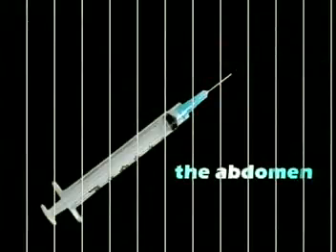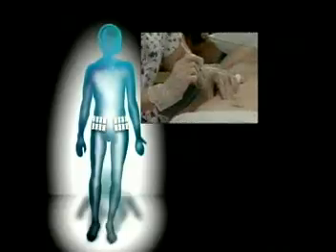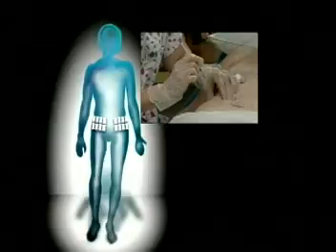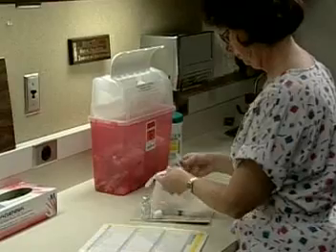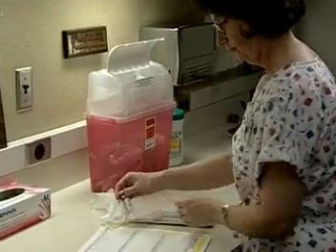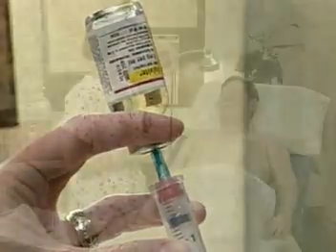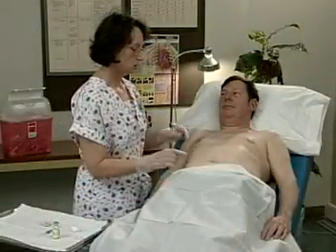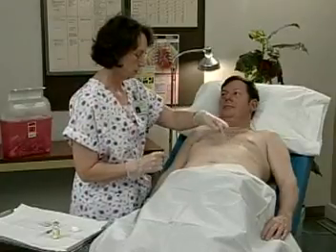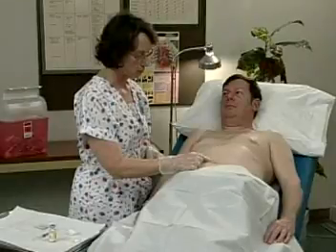For this demonstration, 2 inches of tissue will be pinched and the injection will be given at 90 degrees. A 25 gauge 5/8 inch needle is selected. Verify orders and assemble supplies and medication. Draw up the medication. Locate the landmarks. Rick, I'm going to give your injection to you in your stomach today. The abdomen below the costal margins to the iliac crest, 2 inches out from the umbilicus.